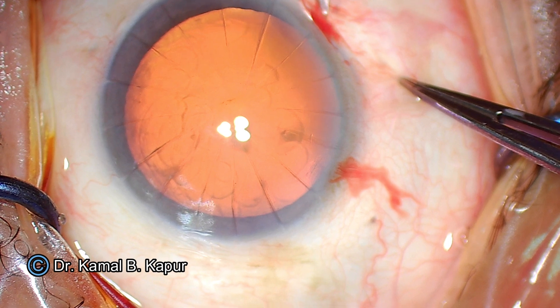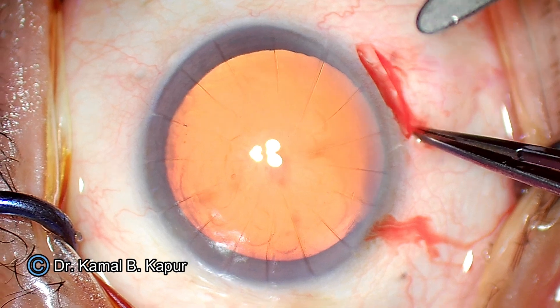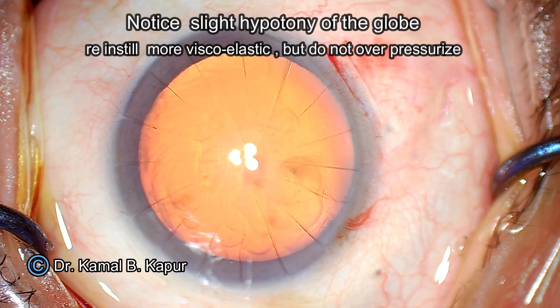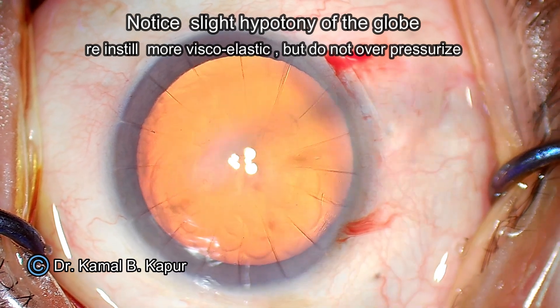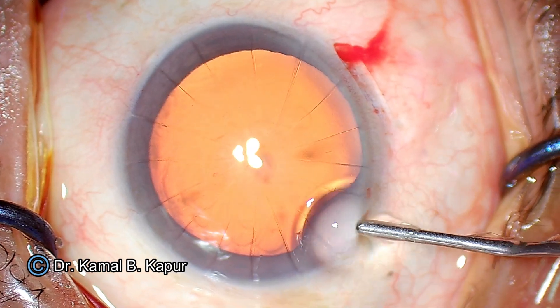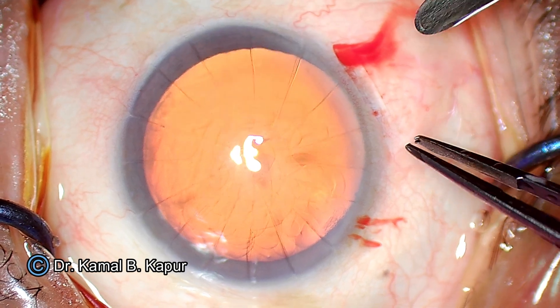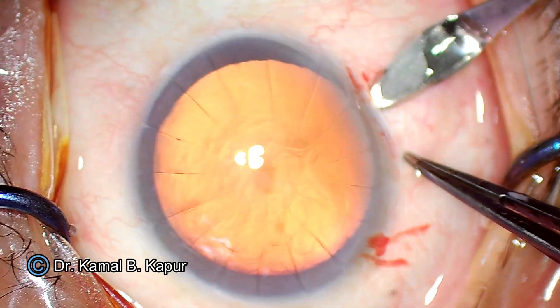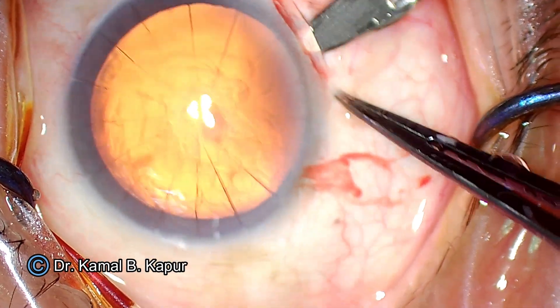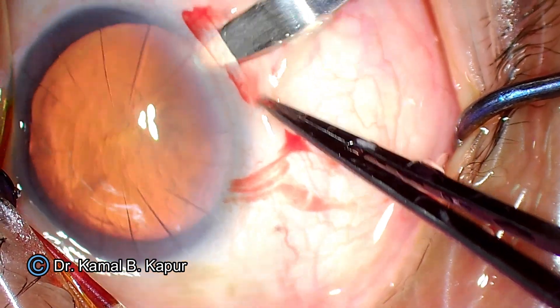Approximately 750 microns or 0.75 millimeters from the limbus, create a linear cut into the sclera which is approximately 60 to 70 percent of the depth. Before you create the scleral tunnel, it is a good idea to pressurize and make the globe tight because this gives you a much more controlled and good plane of the scleral tunnel. We proceed by creating a linear cut into the sclera aimed to enter into the cornea between two cuts — that's the most preferable situation.